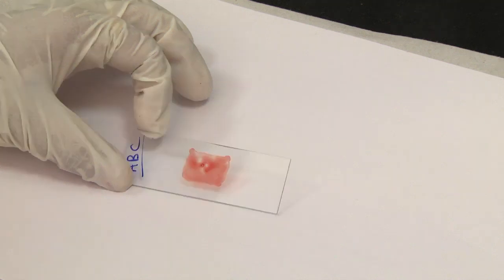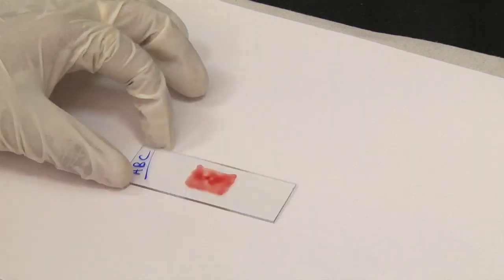Insufficiently dried smears and smears that are too thick can detach from the slides during staining. Protect thick smears from hot environment.